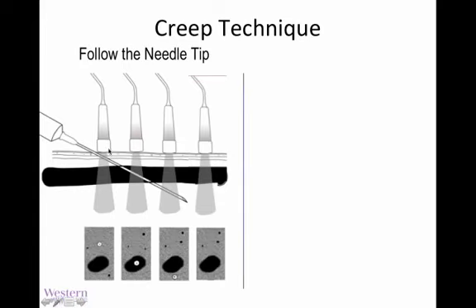So the way to get around this is to advance your probe beyond the tip of the needle, such that this is your ultrasound screen display, and then move it back to be confident that this is then the distalmost portion of the tip. And that way you can then advance your probe again a little bit beyond, and then advance your needle into the field of view, and you slowly do kind of a back and forth approach, which I'll show you again on an ultrasound image.